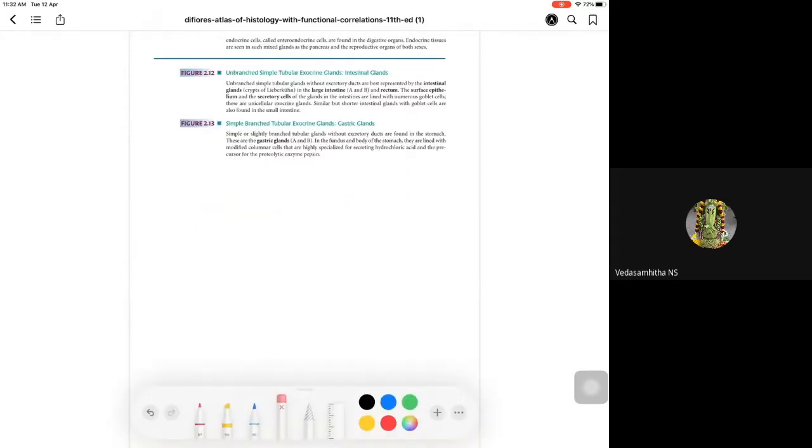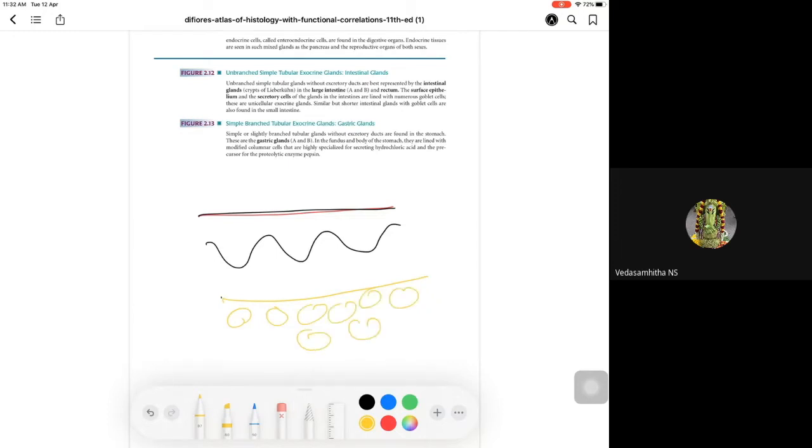We are going to see the skin. Skin, we have first the surface, then we have folds like this portion, and then we have this portion, and then we have adipose tissue here. The major portions of the skin: this portion is known as epidermis.